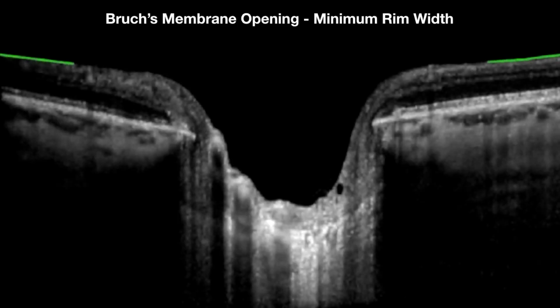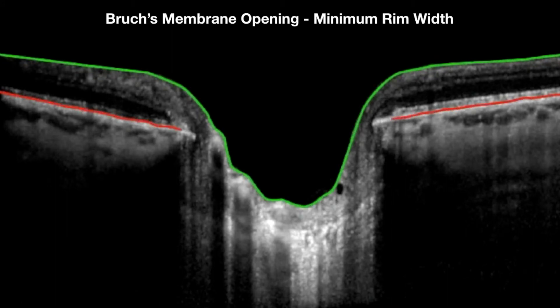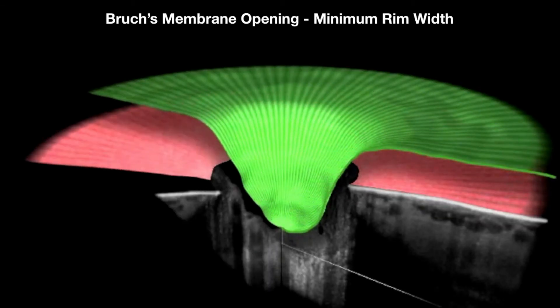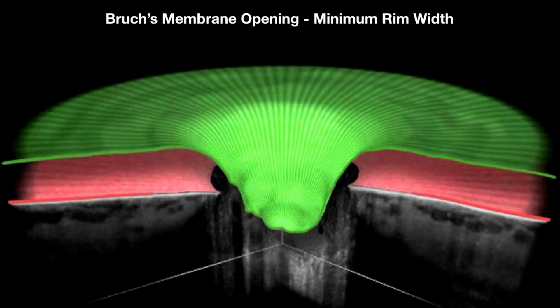Let us see a 3D animation of Bruch's membrane opening minimum rim width. Once the internal limiting membrane, Bruch's membrane, and Bruch's membrane opening are segmented, this three-dimensional view beautifully reveals the Bruch's membrane opening minimum rim width.